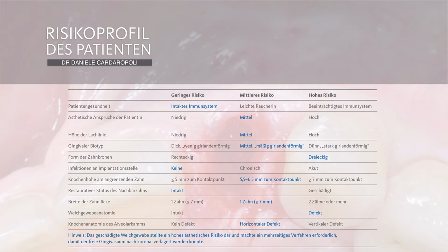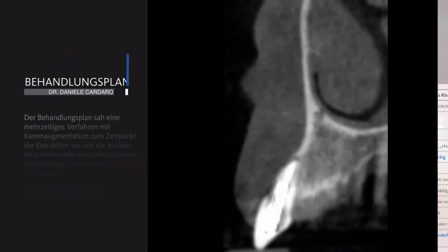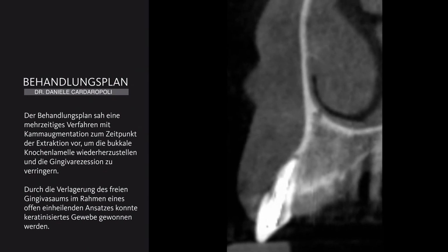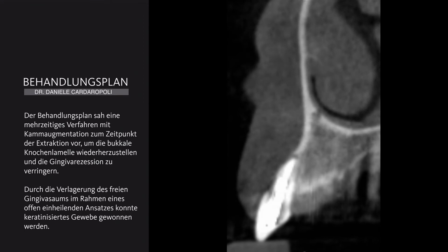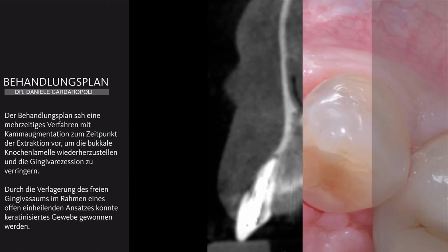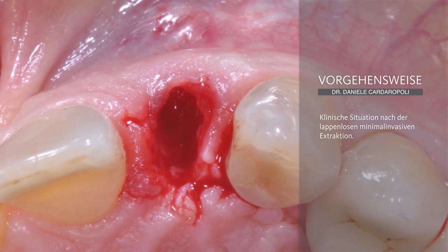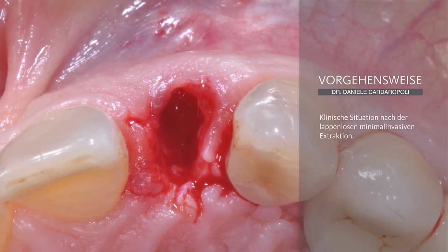This situation presents a high risk for aesthetic failure, and so we have the need for a staged approach in order to coronalize the free gingival margin. The treatment plan is about a staged approach with ridge augmentation procedure at the time of tooth extraction. And so the procedure is with a flapless approach, minimally invasive extraction of the lateral incisor.